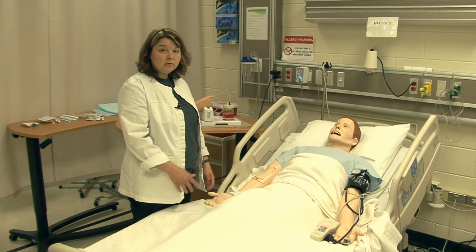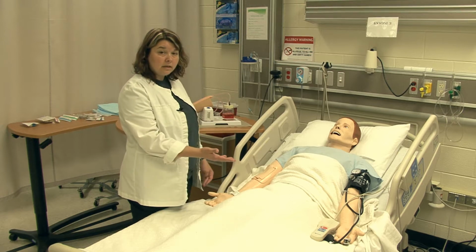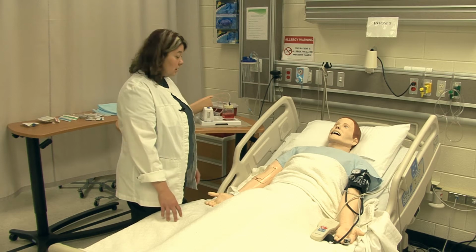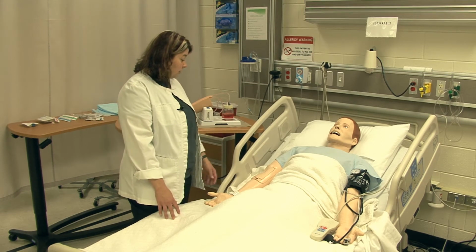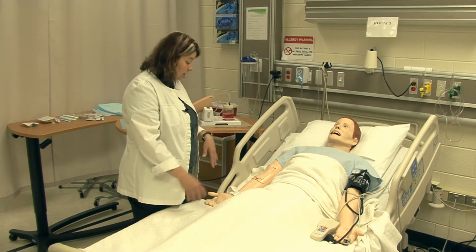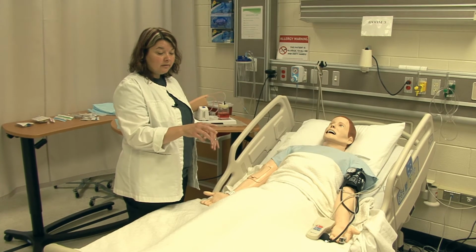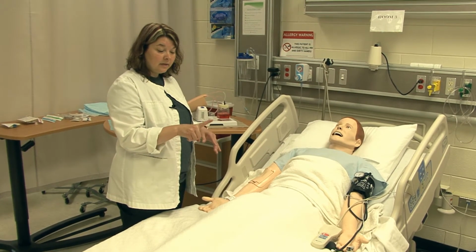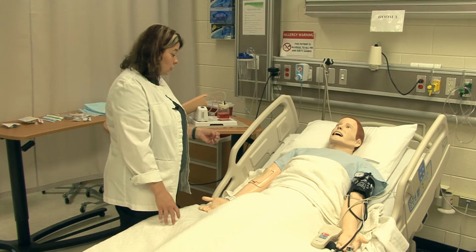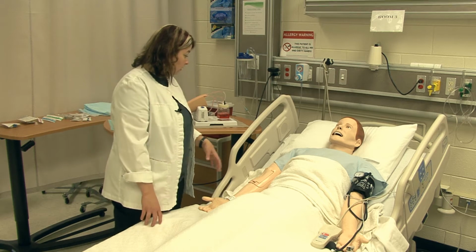You might want to consider your patient's dominant arm, because sometimes they might like it in the non-dominant arm so that it doesn't interfere with movement. Another thing that could affect placement, you might not want to put it in the bend of an arm, for instance, up in the antecubital area. You might not want to put it in the wrist, which has a bend, because your catheter is a pliable plastic, and so it can get bent easily if it's in an area like this. Sometimes you don't have any choice. That might be the only vein that you can see and palpate and find appropriately.